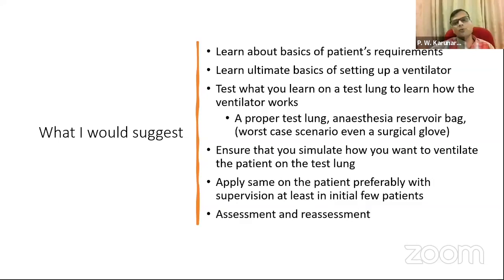One of the most important things is not just that you can set up the ventilator, but what is happening to the patient: the assessment and reassessment. I can't stress that enough. If you just connect a patient to a ventilator and the ventilator is malfunctioning, you have no idea. So you have to assess the patient, then you will realize something bad is happening. Ventilator can be a life saver.